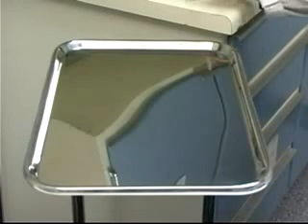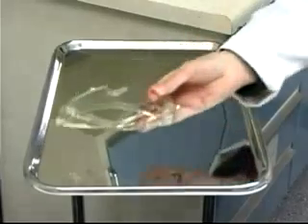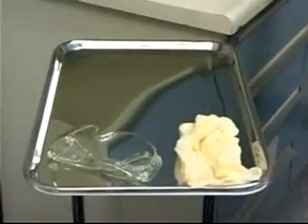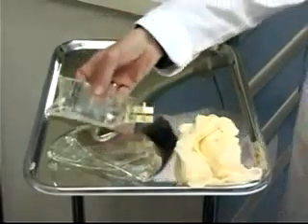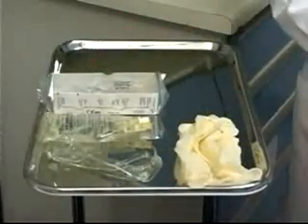The first step is to observe universal precautions, and in order to do that, we need to use protective eyewear and protective gloves. The next thing we'll need is some IV solution and tubing to connect to the catheter when it's in place, and you'll need a bag of fluid and the appropriate IV tubing as well.